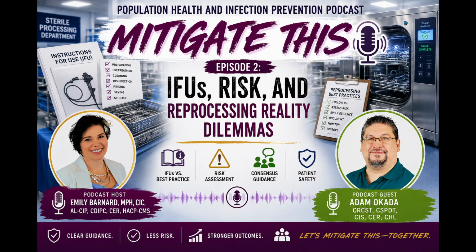I would also recommend risk assessments. I am a huge proponent of them. I think that is the best way to avoid problems later. If you do a risk assessment and you have that documentation, and the surveyor comes in and says, why are you doing things different than what it says in the IFU?, you can go back to that risk assessment and say, this is what we did, we tested this, here were our results, and this is why it's in our process. So risk assessments are important. I believe they are a valuable tool in our arsenal. And if you don't have them and you're doing something not by IFU, I guarantee surveyors are going to take issue with it.